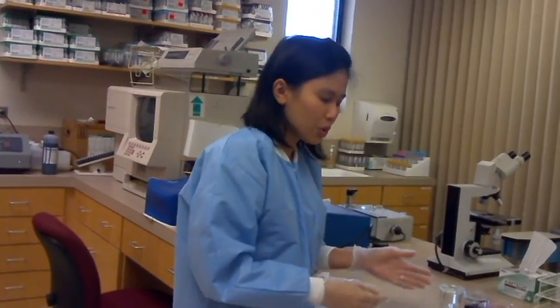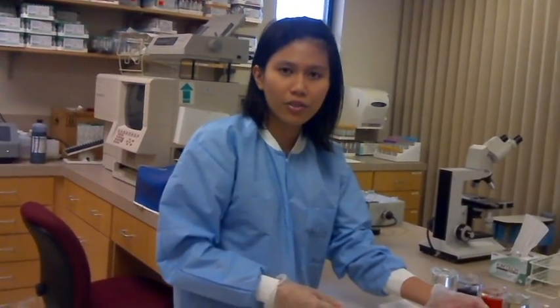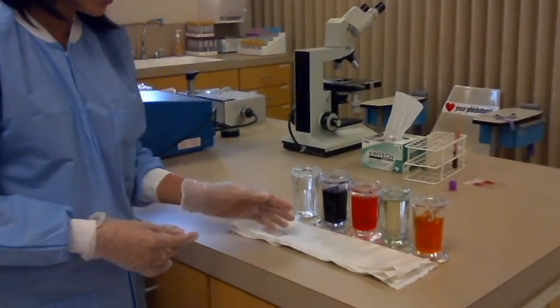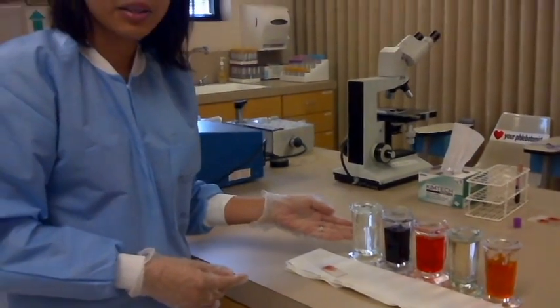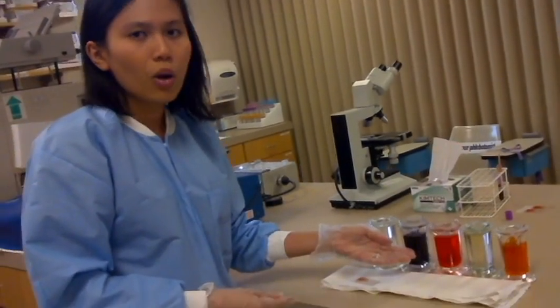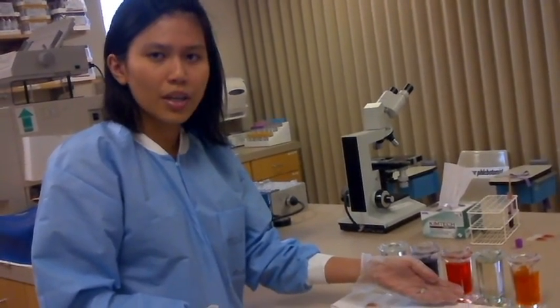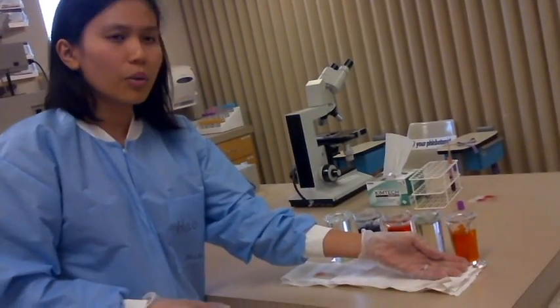After that, you will prepare your solutions for staining. I have 5 cups of solution. The first cup is methanol. The second cup is methylene blue. The third cup is eosin. The fourth cup is water. And the final cup is buffer.